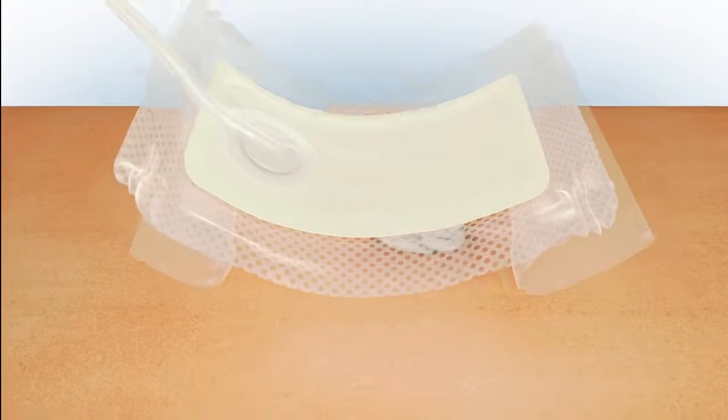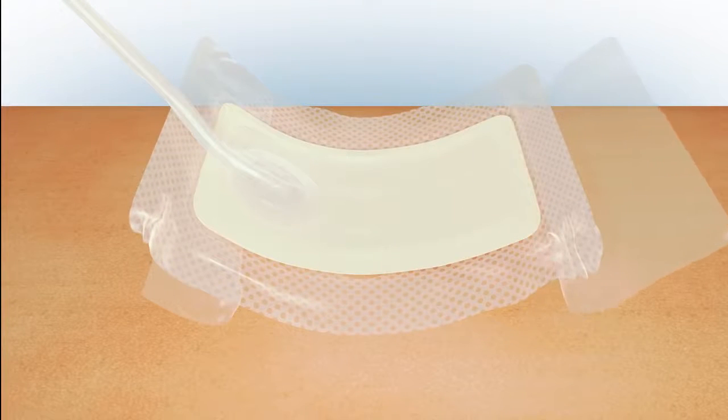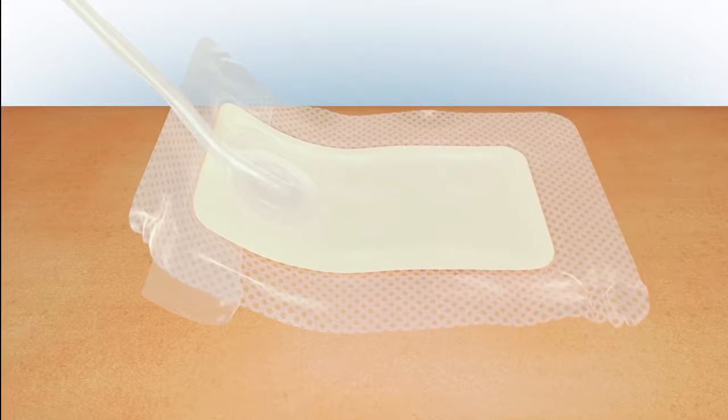Place the dressing centrally and flat over the wound and surrounding skin, making sure that the port is positioned away from the wound and is uppermost over intact skin. It's important that you don't place the port directly over the wound.